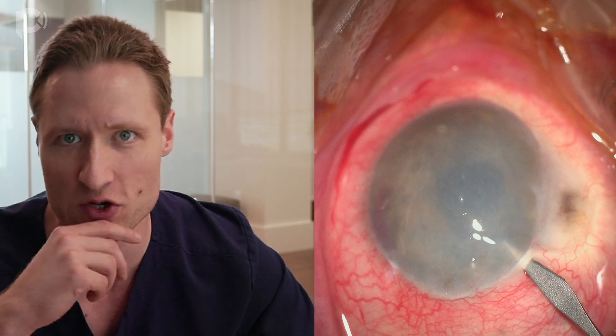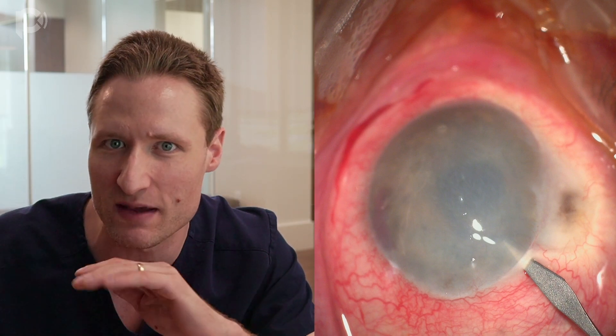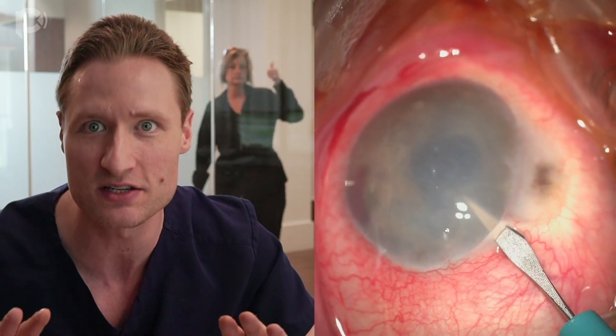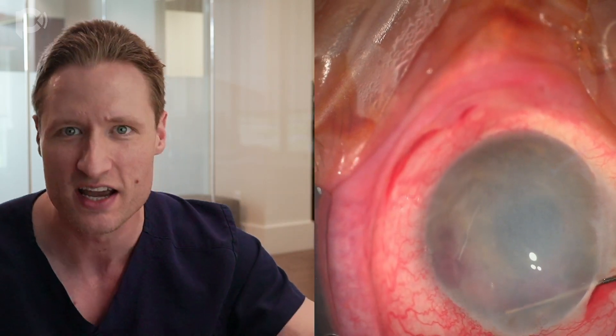So how do we start the operation? The idea is to make a paracentesis with a 15-degree blade angled up just to try to wiggle into a space in the periphery where there may be some room to maneuver. I'm making a single paracentesis angled up into the anterior chamber, then using a long cannula with lidocaine to inject a bit of anesthesia. I'm bluntly dissecting to try to create a little space between the back of the cornea and the front of the iris, but not overdoing it.